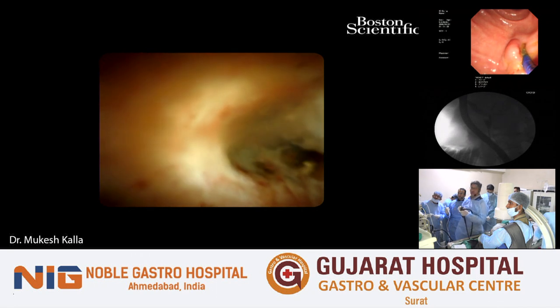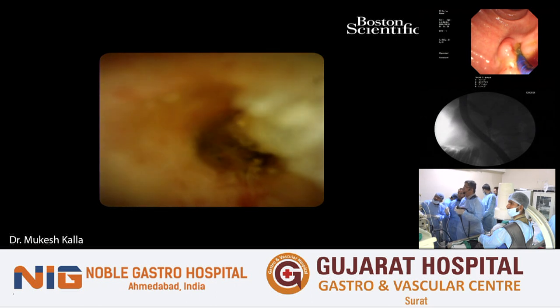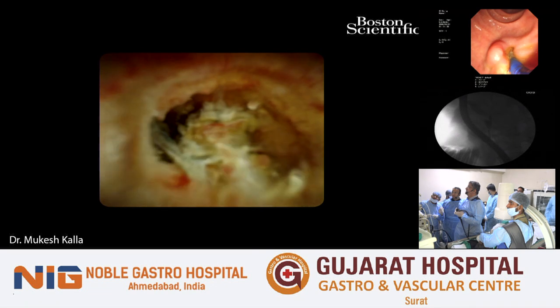But anyhow, let's concentrate on the SpyGlass picture. It's almost like doing upper GI endoscopy, and we are there in the cystic duct, luckily, and you can see the muck there.